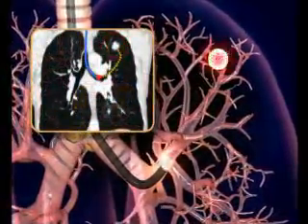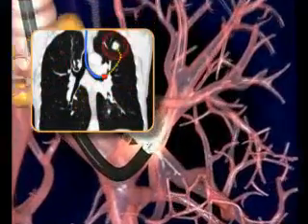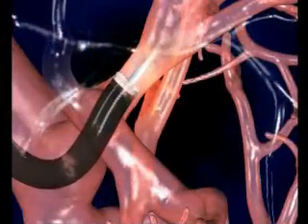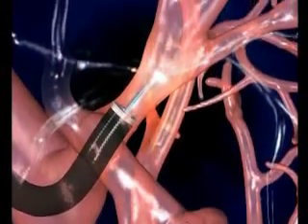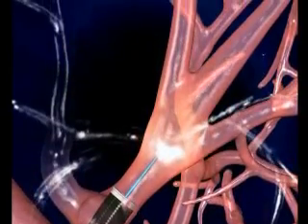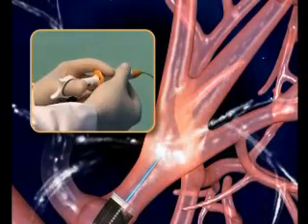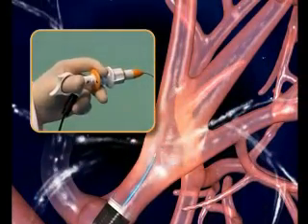The catheters are inserted into the bronchoscope's own working channel. When the bronchoscope cannot proceed anymore, the steerable navigation and guide catheters are advanced and steered by turning and pulling the dial on the catheter handle.